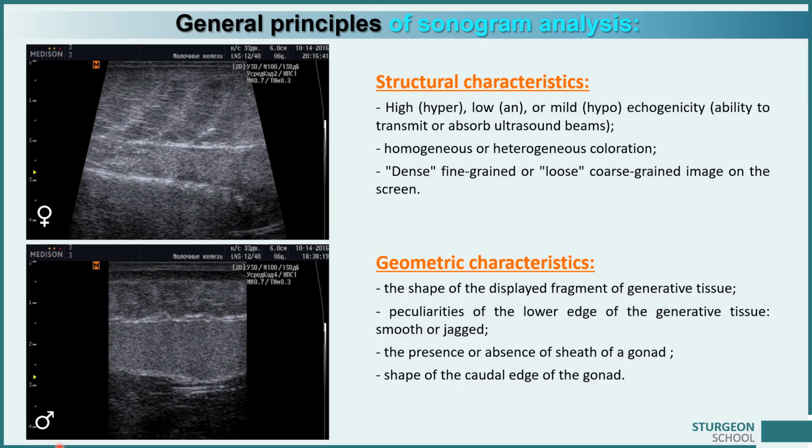Next, the visual homogeneity and density or graininess of the image is evaluated. What is meant? On the lower sonogram we see a visually quite homogeneously colored fine-grained band, which both above and below is tightly adjacent to the brighter envelopes. On the upper sonogram the same area is visually more loose, more granular, the color distribution is not homogeneous and can be compared, for example, with clouds, especially in the right part.